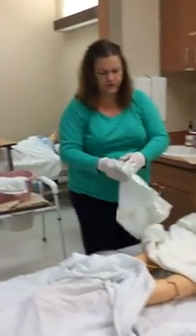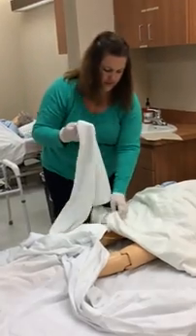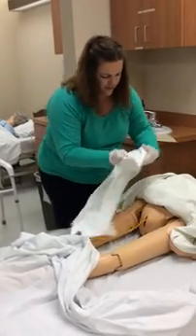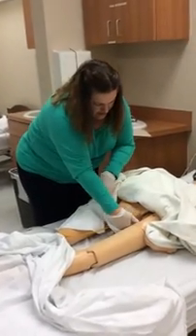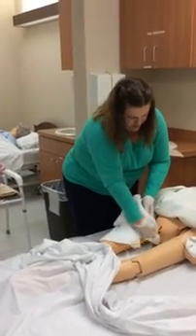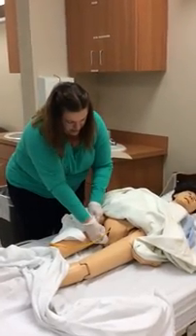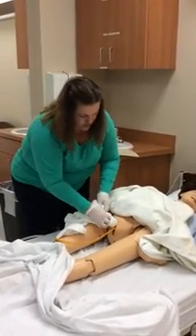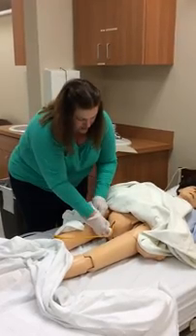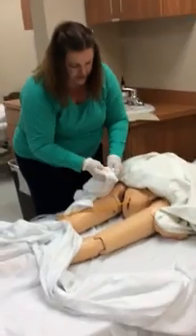Now I'm going to dry you. Now your towel is big, so obviously you're not going to hold the whole thing in the hands. I'm going to cover you. I'm going to dry this side. Just make sure you change the spot on your towel with each drying stroke. Going down the middle. Don't go like this, lift your towel up, and then go back down, because that means that you're using the same spot for two different movements.